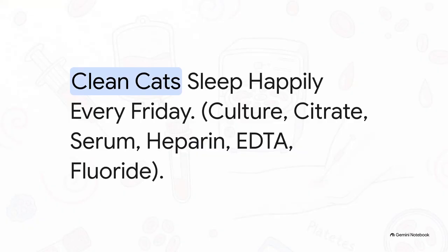Crazy, right? To avoid this kind of nightmare, medical professionals use memory aids. One highly satisfying mnemonic to help lock in that sequence is clean cats sleep happily every Friday. Culture, citrate, serum, heparin, EDTA, fluoride. It's a simple little sentence, but it literally saves lives by maintaining chemical purity.